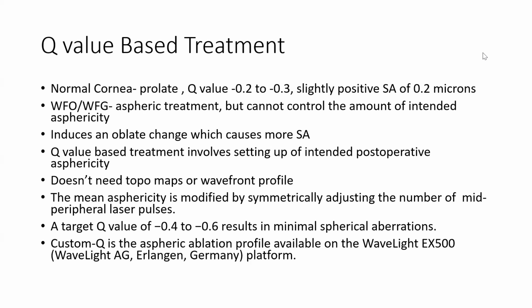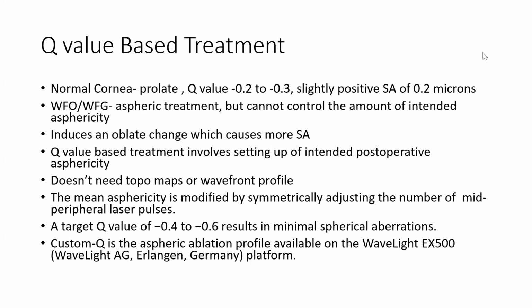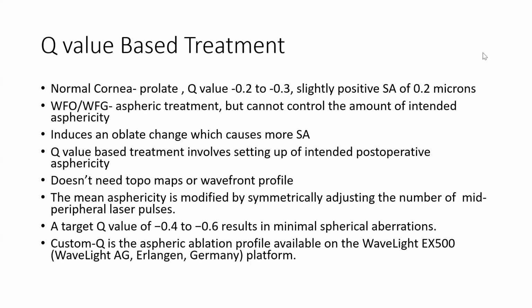Okay, and Q value is measured at what degrees? Q value will change at different degrees from the center. Like at 30 degrees, it will be something else. At 20 degrees, it will be something else. Which one are you going to use? Did you know that Q value will change as you move out from the center to the periphery of the cornea? Yes, sir, because it measures the asphericity of the cornea. So which one are you going to use? Because Pentacam will give you values at several points. Which one are you planning to use?